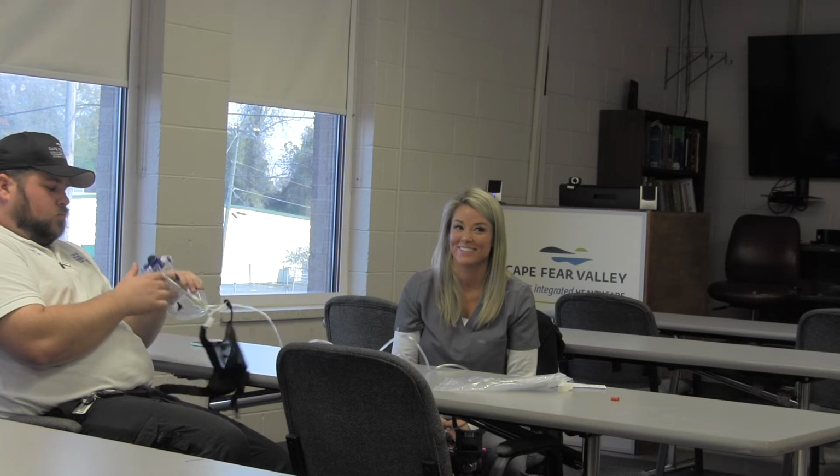And we'll have the medium and the large mask. I say the medium should fit about 85% of the patient population, but you guys got 8 boxes of the large ones, so we'll see how long that'll last you. We got a lot of large patients. Oh, you do? Thanks, Colin. Compliment. I'm healthy. Exactly.